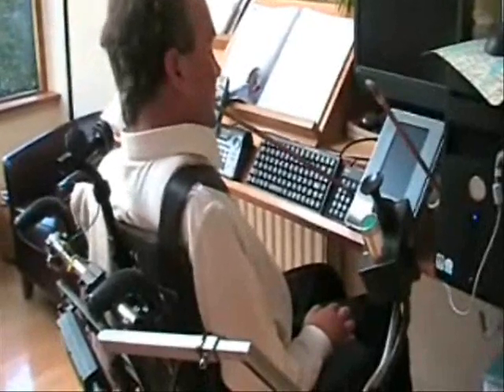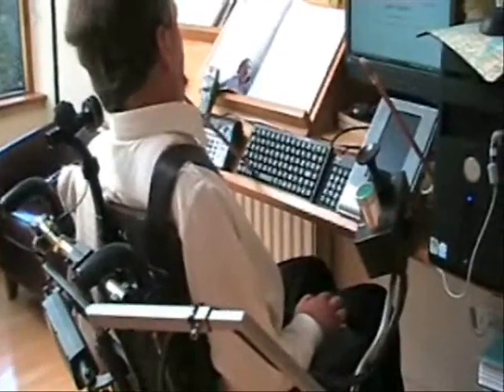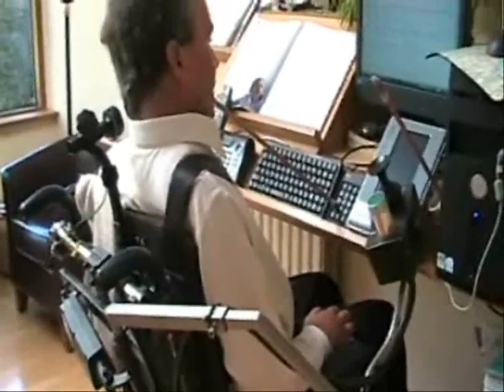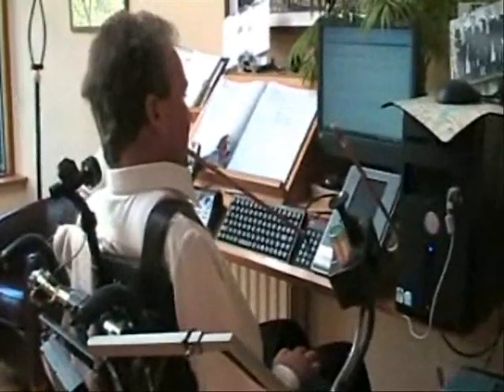So now I can use the keyboard and work on both sides — on the left hand side and the right hand side — and use the mouse buttons and everything without putting so much strain on my neck.